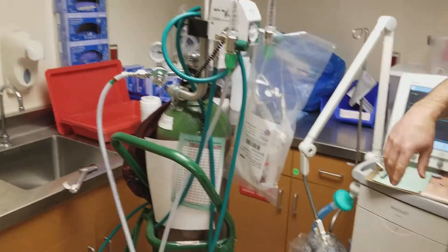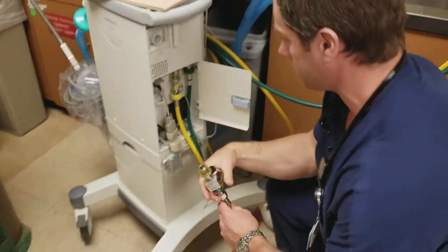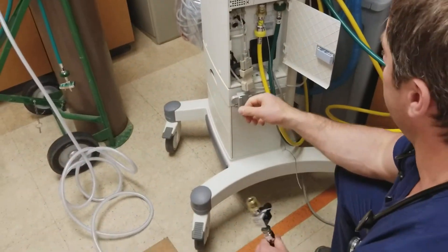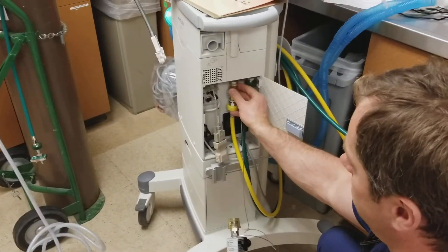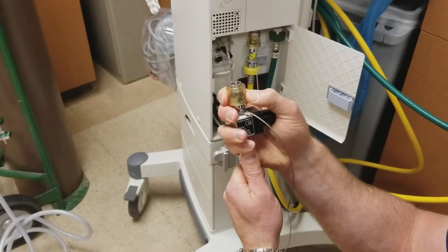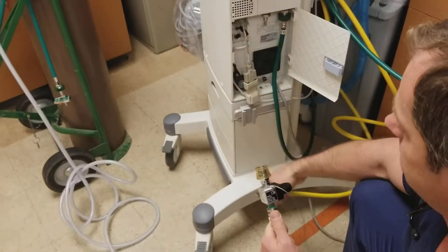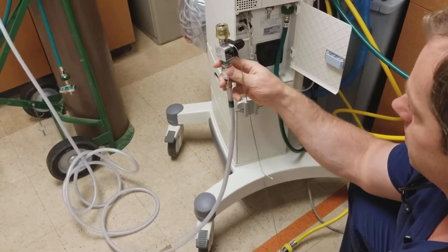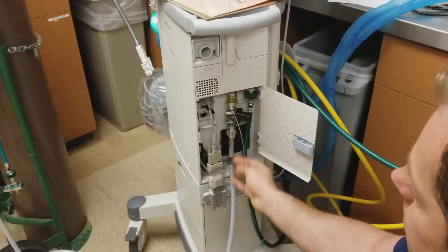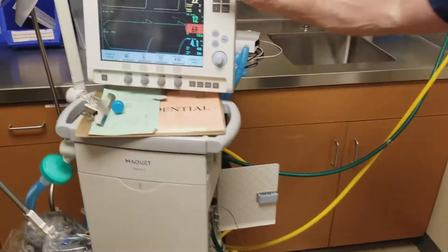We've got some helium in there. Now we can make our switch from air to helium, or the helium-oxygen mix that we have — the 80/20 mix. We can just pull this down — it moves just like that — and that allows us to disconnect. So we'll pull the air one down, right off, and then we can push the helium one right on. Now we're connected.